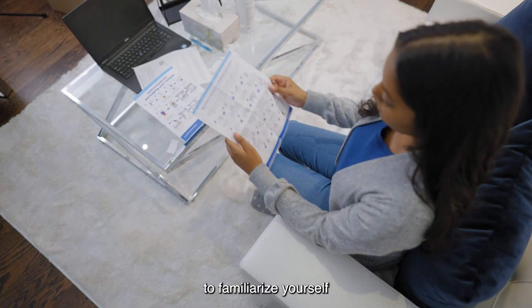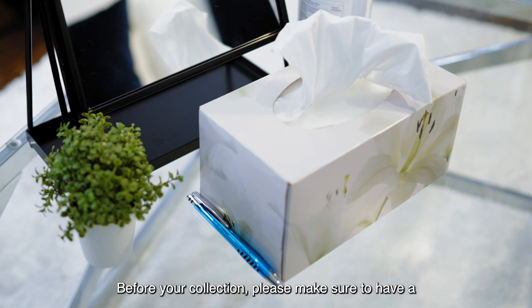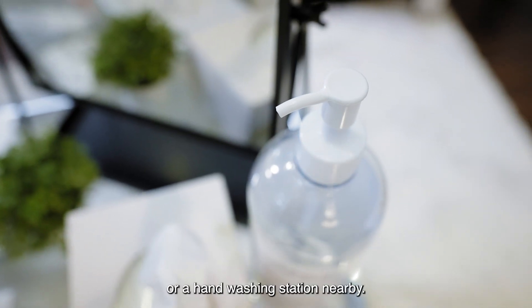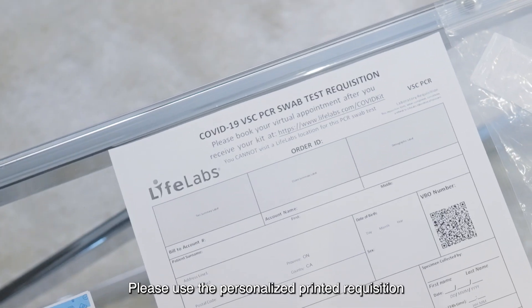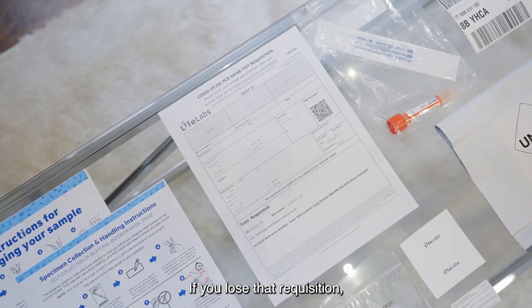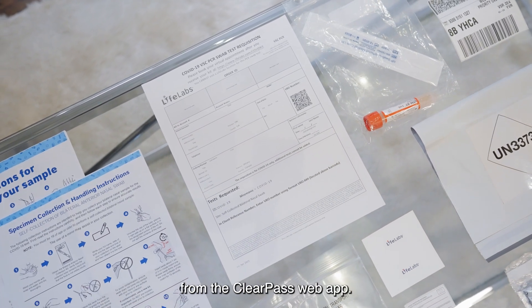Read the collection instructions to familiarize yourself with the collection procedure. Before your collection, please make sure to have a pen and hand sanitizer or hand washing station nearby. You may also want to have tissues and a mirror to help with the collection. Please use the personalized printed requisition provided with your kit. If you lose that requisition, you will need to print your requisition from the ClearPass web app.